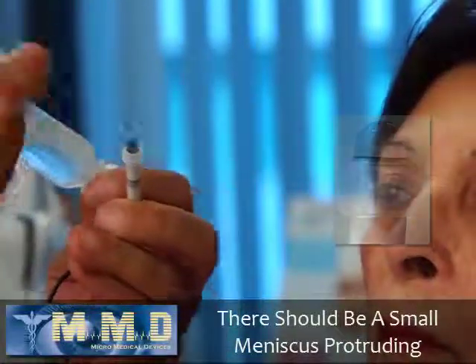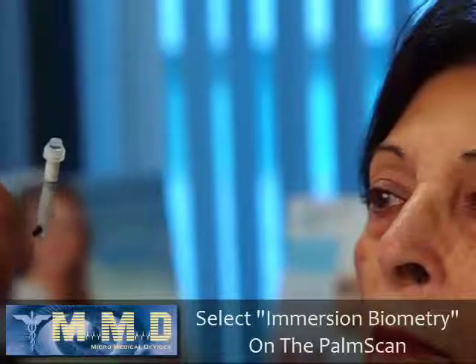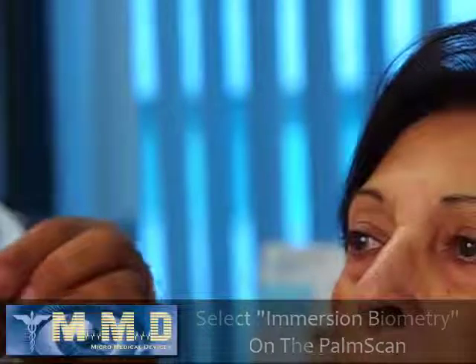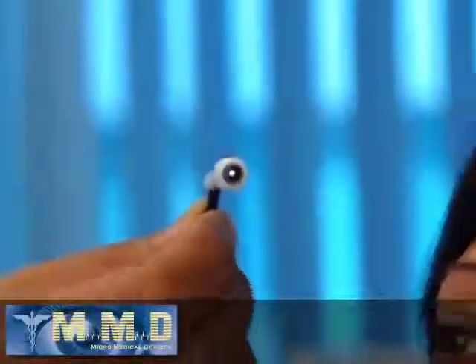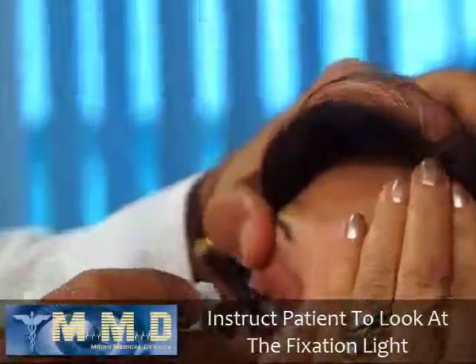Now I'm ready to start the scan by going into the scan mode. Scan. And make sure that immersion biometry is selected. And as you can see, there is a blinking red light. At this point, I will instruct the patient to cover the fellow eye. Please cover your eye. And I instruct her to look at the blinking light.